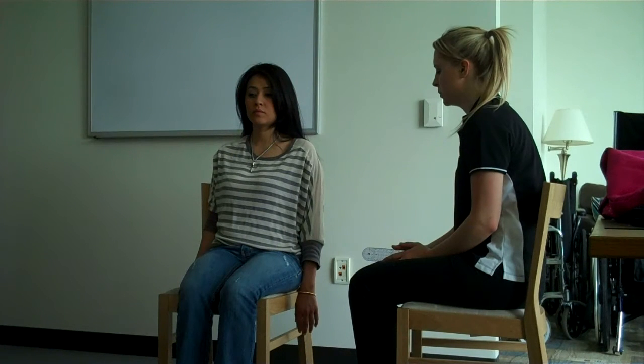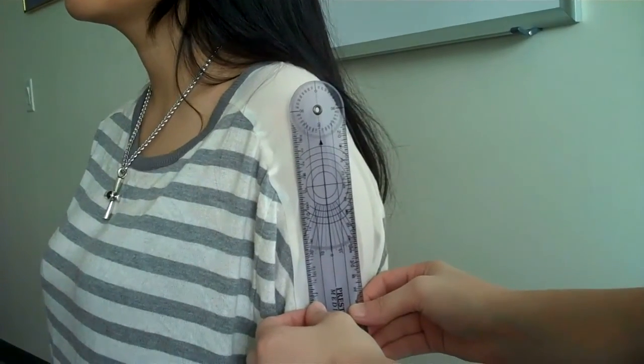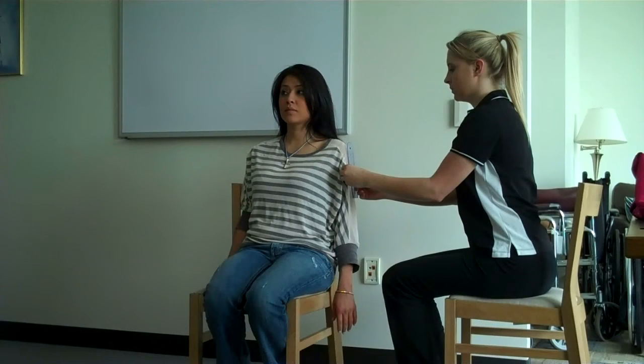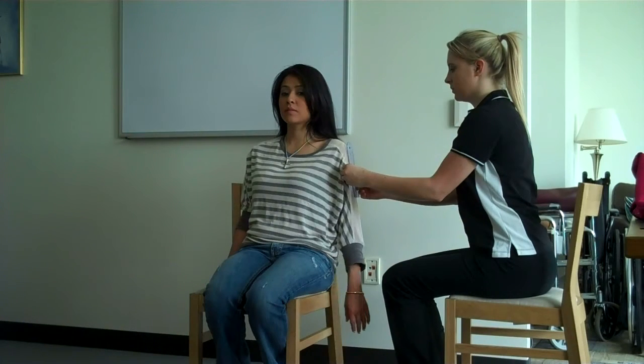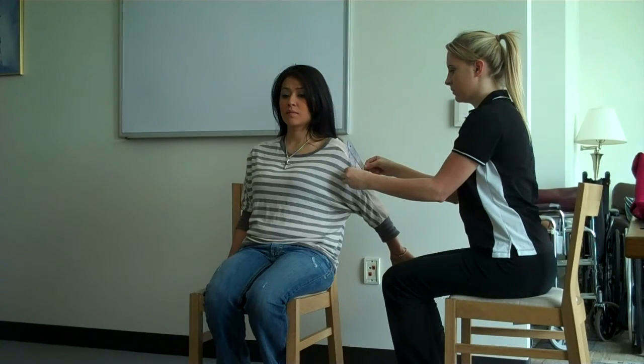For shoulder extension, the subject is seated with no obstruction behind the humerus, and the humerus is in a neutral position. The position of the goniometer is the same as it was for shoulder flexion. The client's arm is brought in the back of the body in a sagittal plane of movement. The measurement begins at 0 degrees and ranges to 60 degrees.